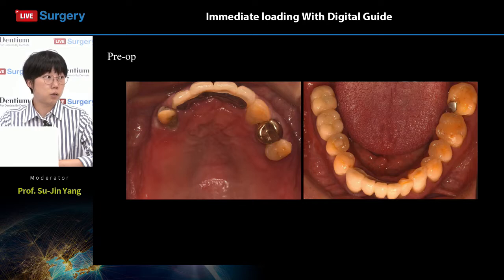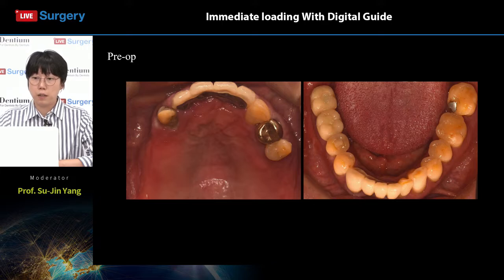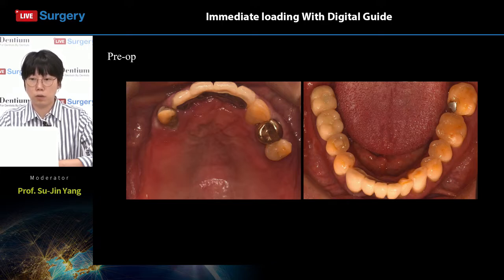Now, in the occlusal views, no attrition is noted and no severe arch width loss or bone resorption is present. Therefore, establishing a cross-bite or edge-to-edge bite relation for the implant crowns and the lower molars seems unnecessary in this case, but it is always important to compare the buccolingual relation of the opposing tooth as well as looking into the crown height when planning an implant surgery.